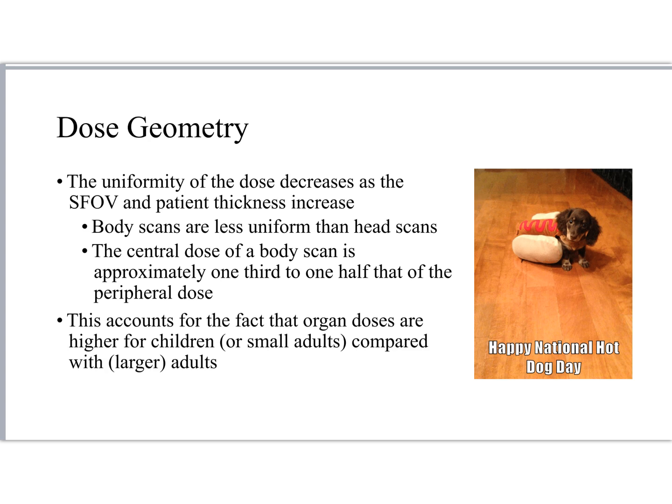And the reason that's important is because the thickness of the tissue differs over the course of the area that we're scanning, right? So if we have a uniformity of dose, that would be great. But the reality is that the patient's body grows or shrinks in size as they move along the z-axis through the scanner tube. And so the dose distribution becomes less and less uniform.